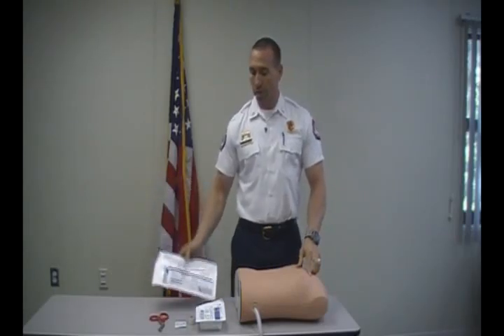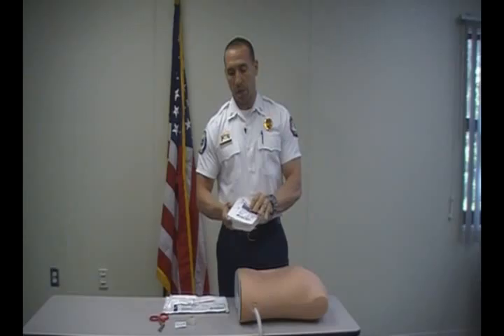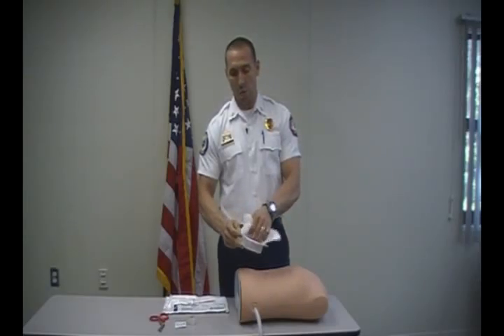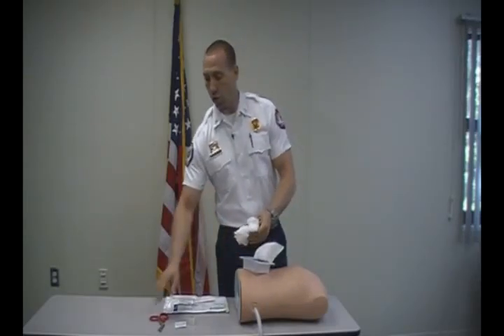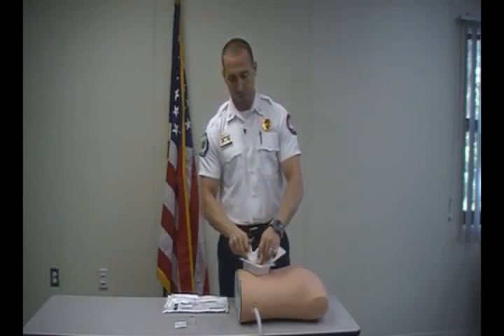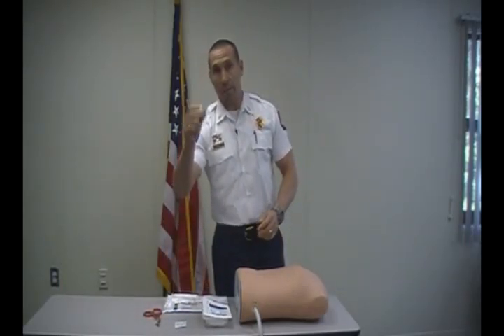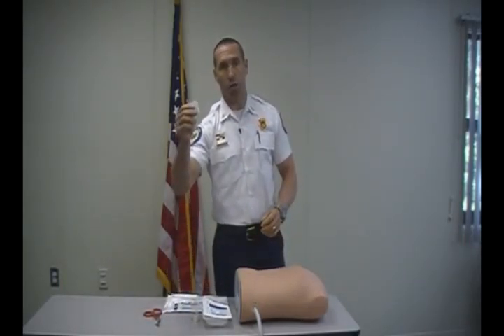Obviously the Turkle Needle. If you want some sterile 4x4 gauze, the best thing you can do is go ahead and open it and use your trauma shears to make a cut. We're going to use this for securing after the procedure. We'll also need some tape and alcohol to clean the site.